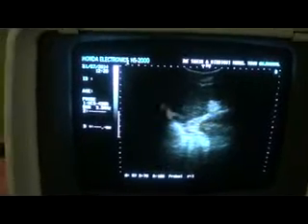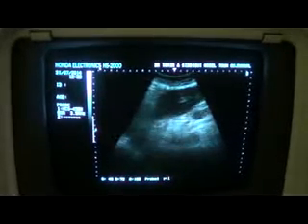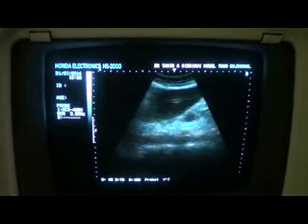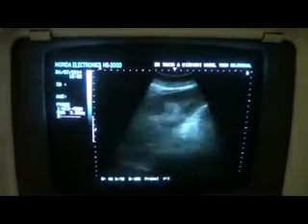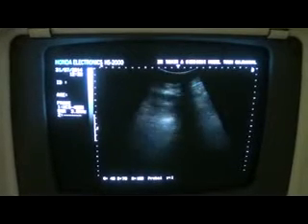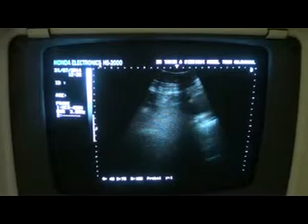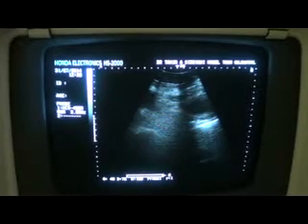This is the left hemidiaphragm and this is the left kidney. The findings are not of renal origin, and not of cirrhotic origin. There is no intrinsic liver pathology. No periportal gland enlargement is seen. There is a small amount of fluid seen in the pericardial cavity.